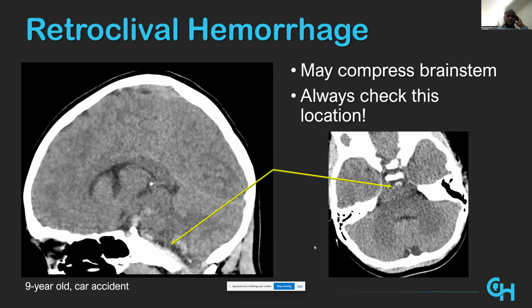Clinically, how would this patient present? And then what do we do for this patient? So clinically, I think it's helpful to think about the injury severity score, or the trauma level. So this injury is typically going to be a higher severity mechanism. So a high severity mechanism should lead you to look more carefully at the skull base.